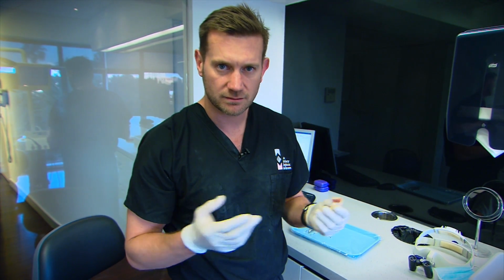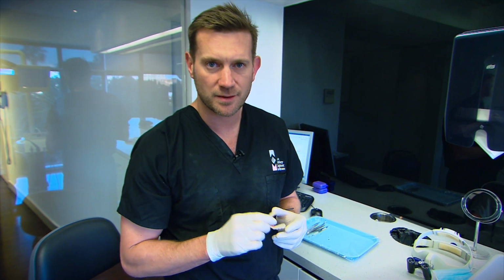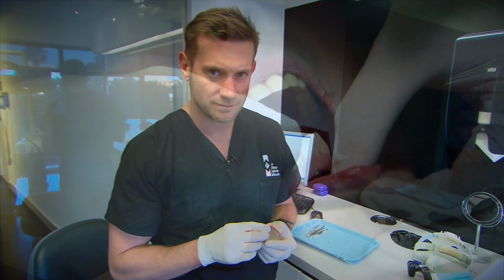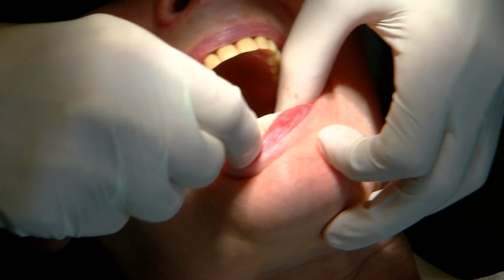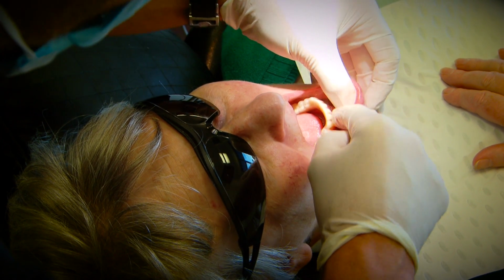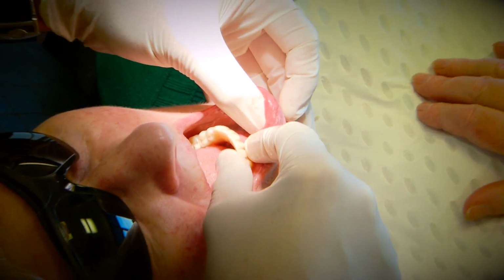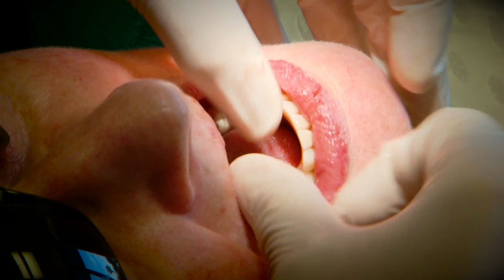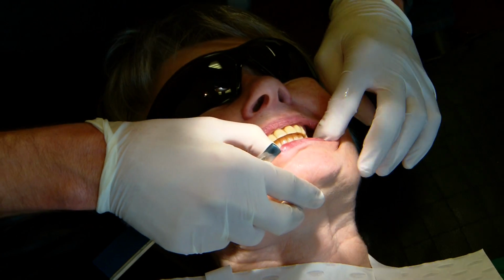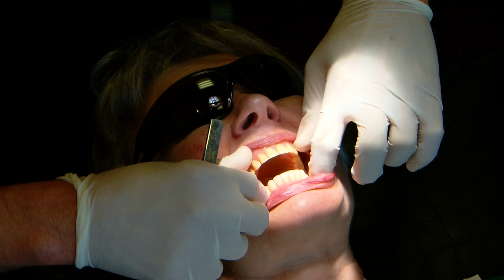Lynn's been recovering in our recovery room, and all that remains now is for us to screw the bridge in, and hopefully it looks good and we're all done. Now at this stage Lynn's still numb, aren't you, Lynn? Mm-hmm. We've screwed in 1, 2, 3, 4 prosthetic screws that are holding the lower all-on-4 to the dental implants inside the jaw. So just check the bite's right and click straight in. Open up there for me. Bite down.